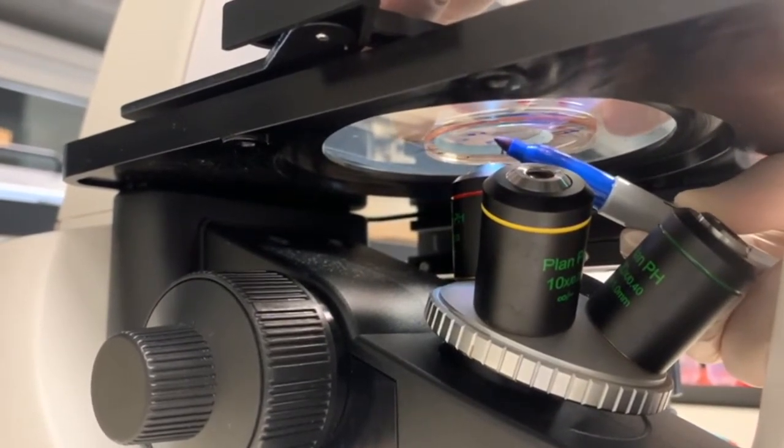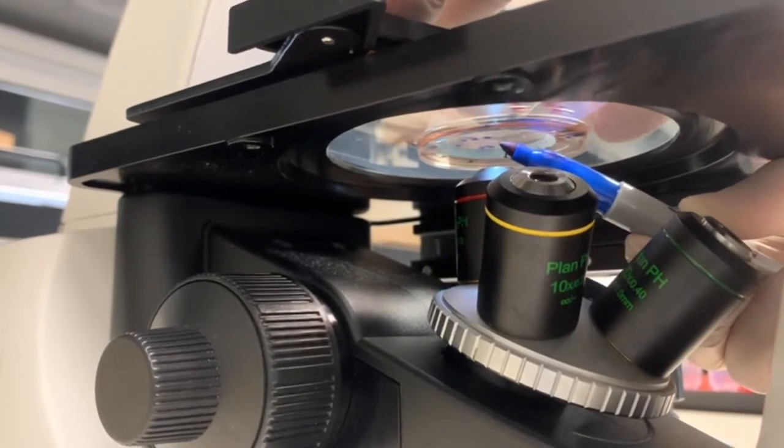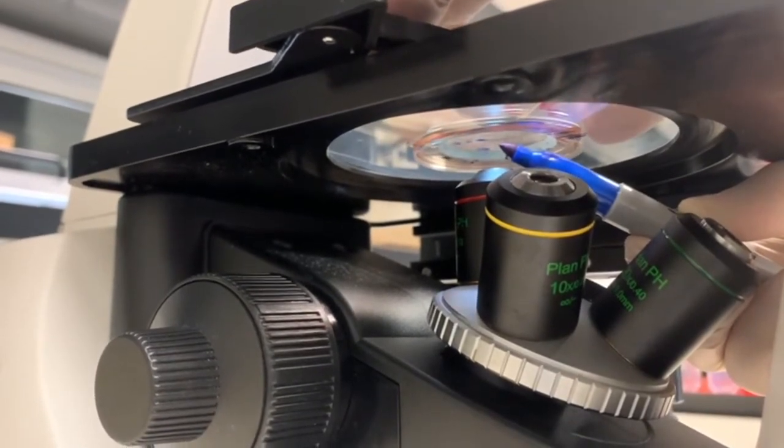Once you've placed your marker under the dish and are able to see the shadow of the marker, use it to mark the differentiated regions.